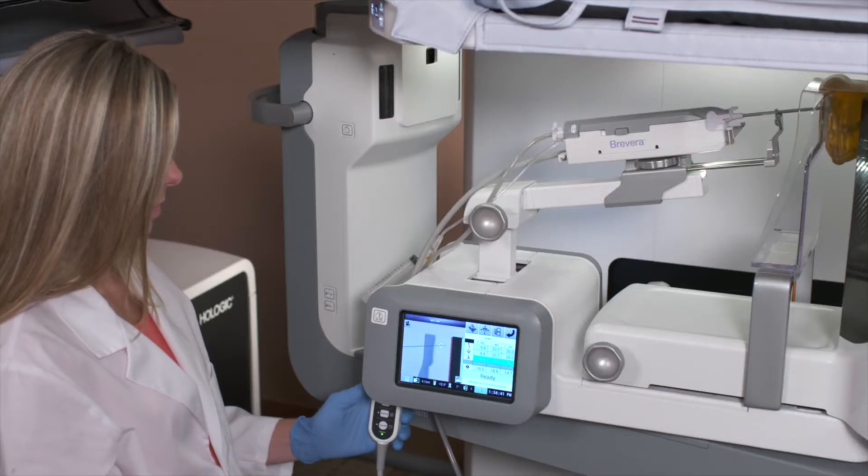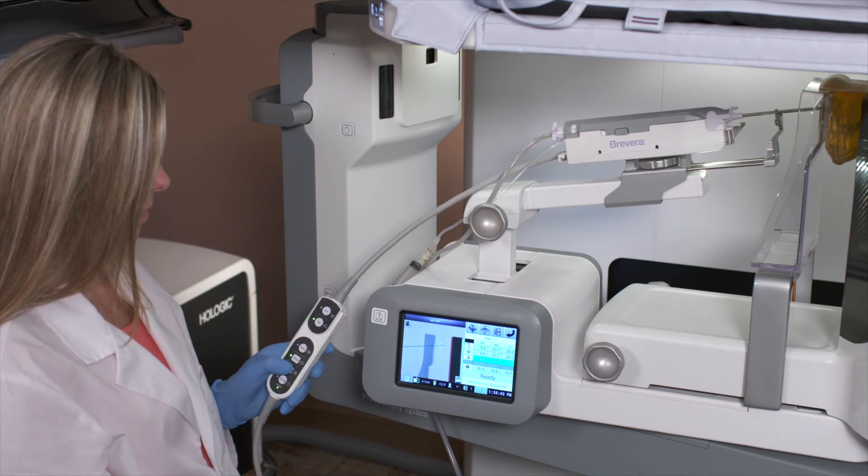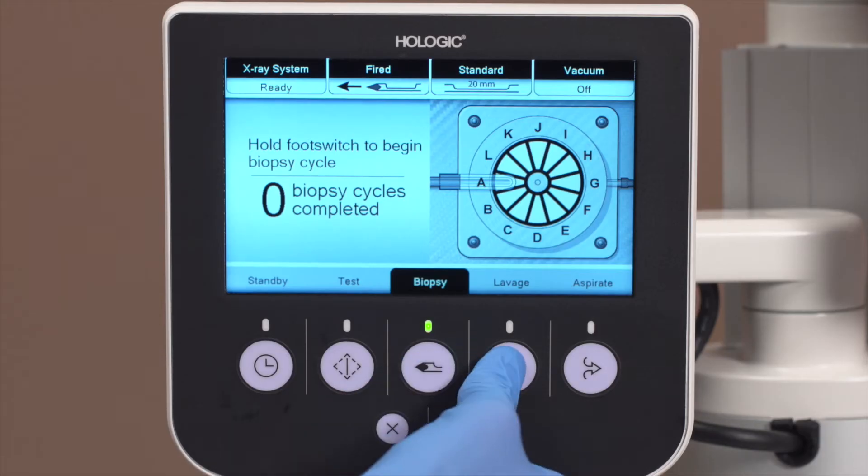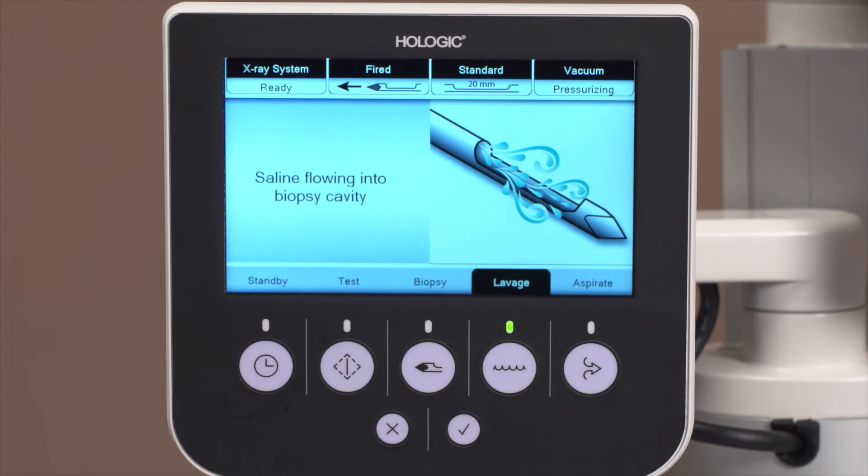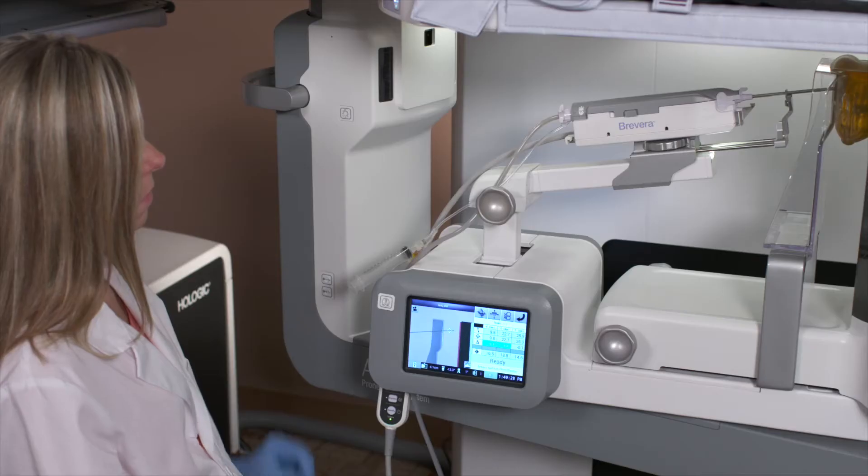Once the biopsy is complete, select lavage on the remote or the technologist display screen. Saline will be introduced and aspirated to irrigate the biopsy cavity, cleansing tissue and other fluids from the site.